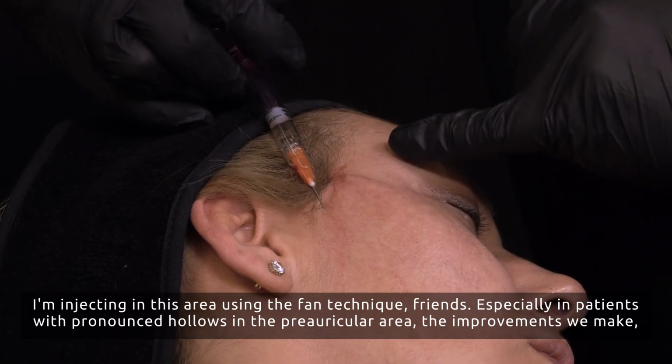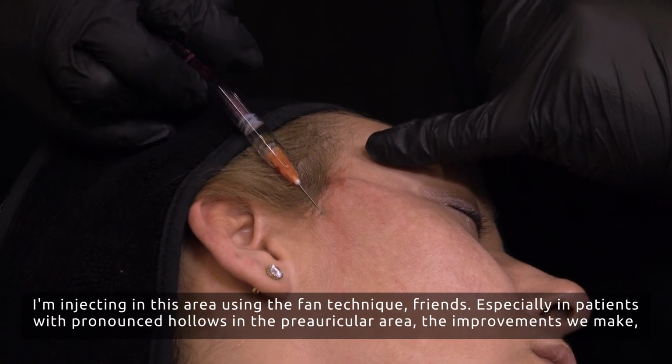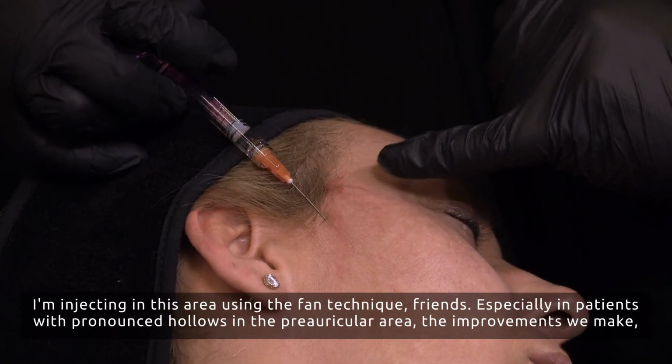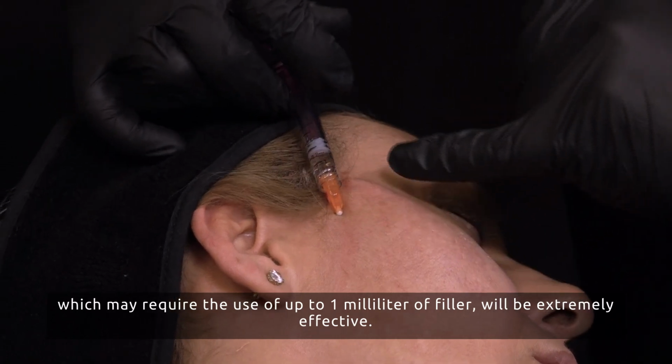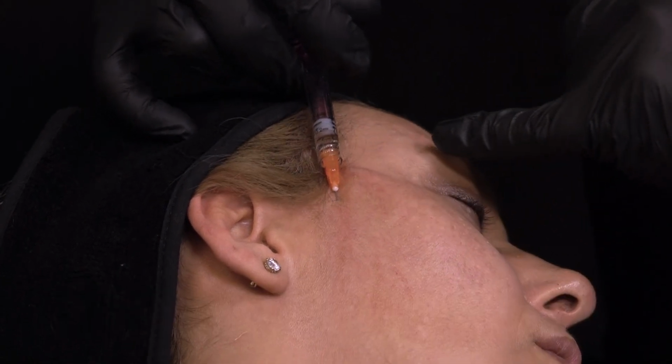I'm injecting in this area using the fan technique, friends, especially in patients with pronounced hollows in the preauricular area. The improvements we make, which may require the use of up to 1 milliliter of filler, will be extremely effective.